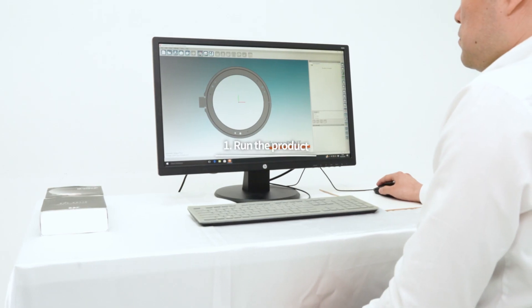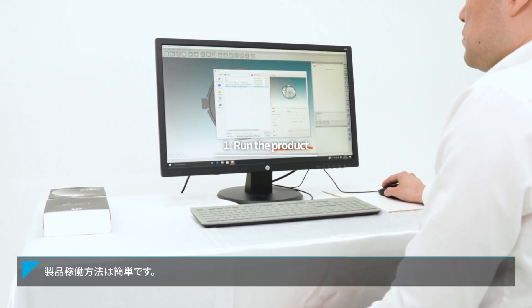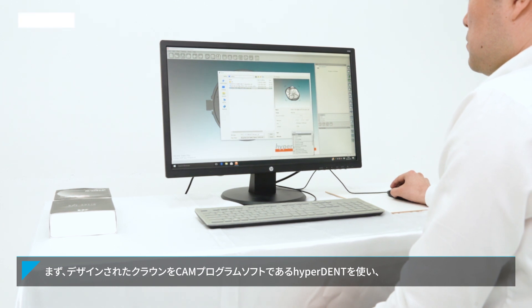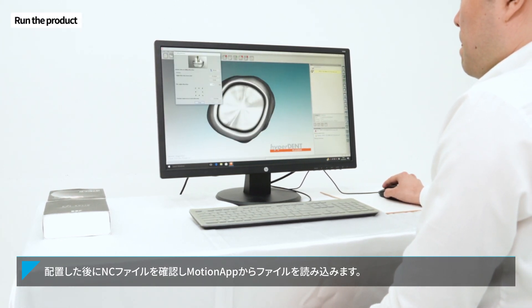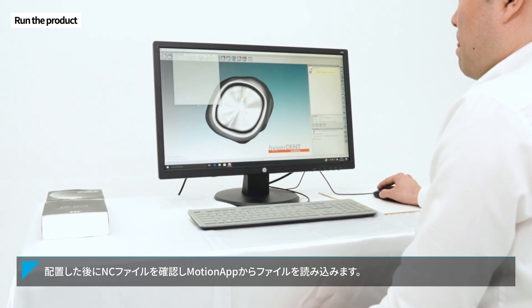Running the product is simple. First, place the design crown using the CAM program. Check the NC file and import the file from MotionApp.